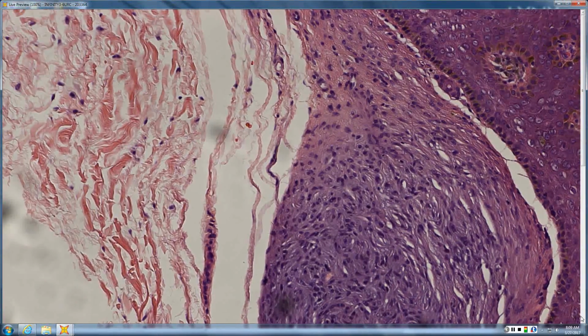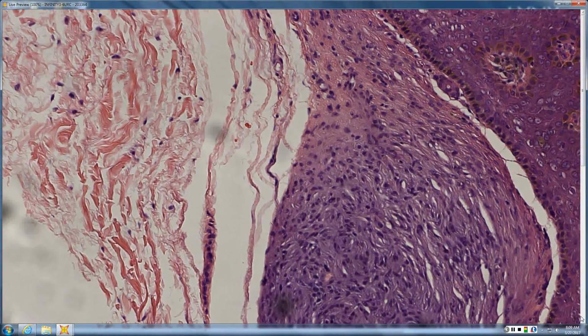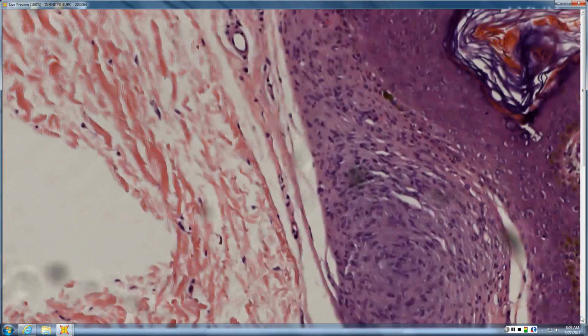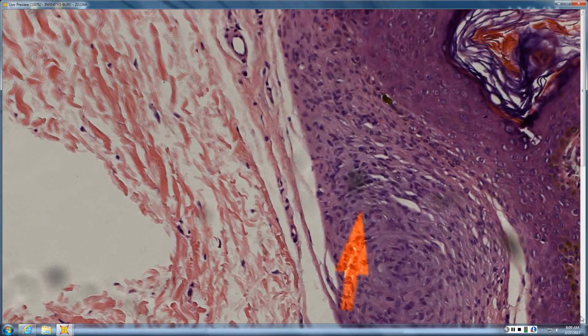That's the one I would have gone for, or anything in the allium family. Yeah. So if the people involved had been better cooks, it would have been a leek or shallot pattern. Unfortunately, they were sort of workaday cooks, so it's referred to as an onion skin pattern. Okay, so this shallot pattern tumor, what would this be?